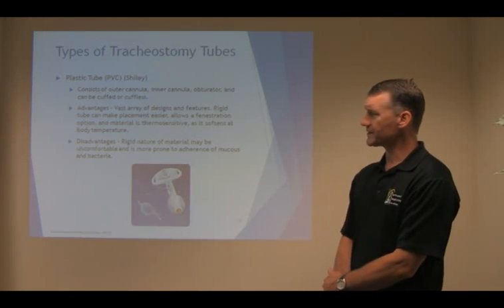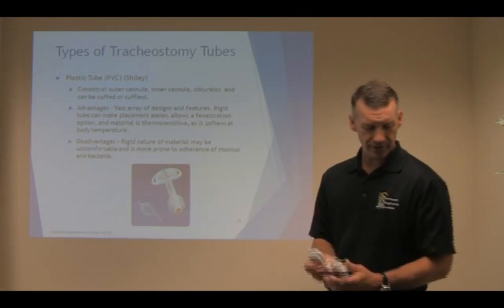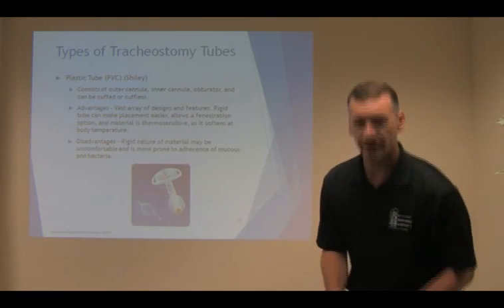The disadvantages: it is rigid, and the nature of the material may be uncomfortable and is more prone to adherence of mucus and bacteria. What we sometimes see, that if a patient has a Shiley in and they can't tolerate it due to the rigidity, we will move up to the Bivona.